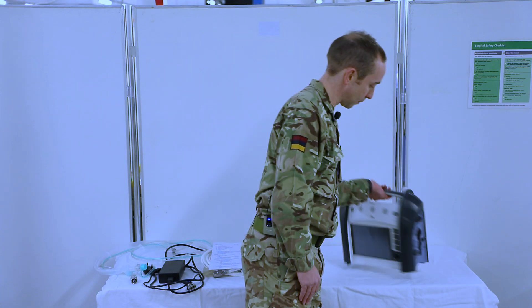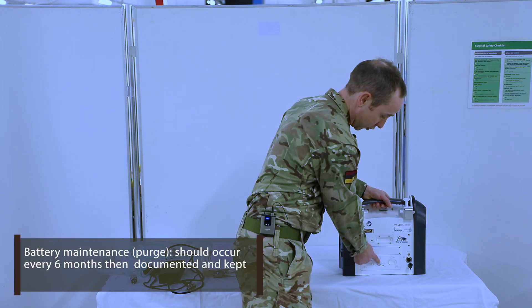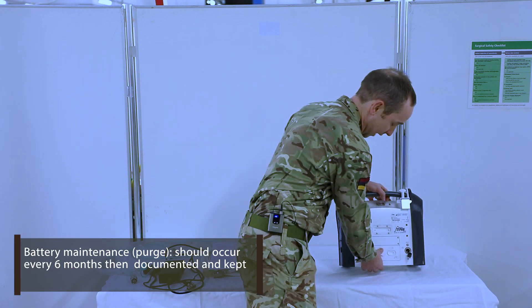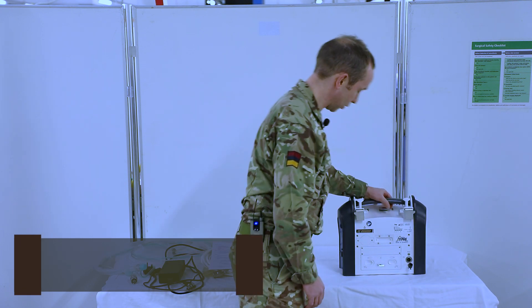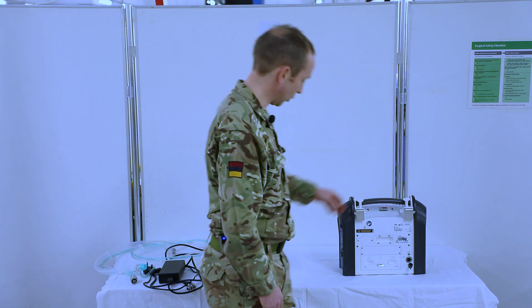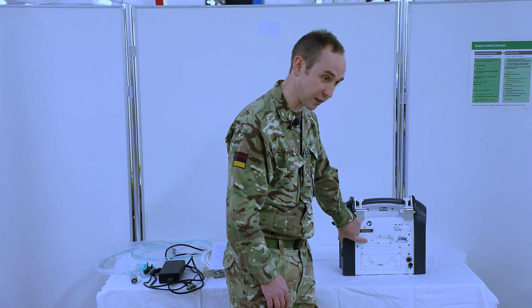Then we're going to inspect the batteries. We have an internal battery which is fixed, and the external battery — we're going to ensure that that is correctly seated and check that it's fully charged. The last thing we're going to do is check that our oxygen sensor is still in place and is securely fitted.